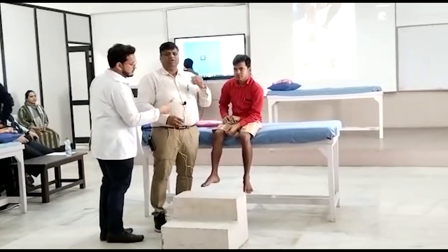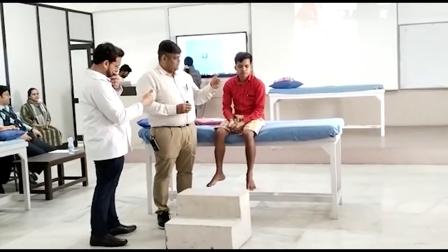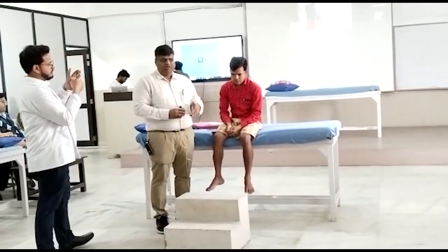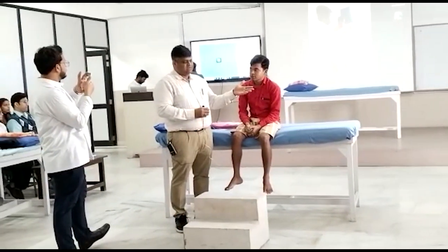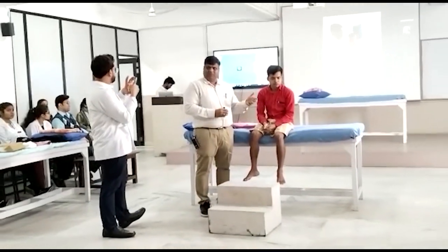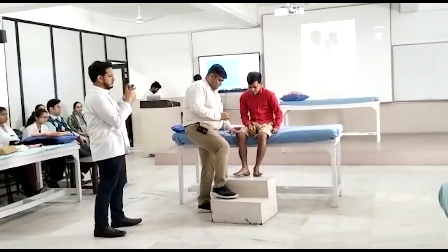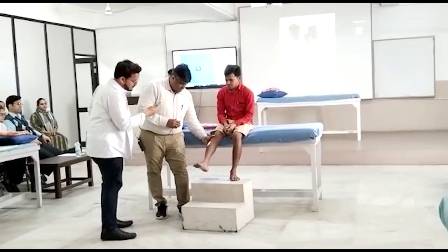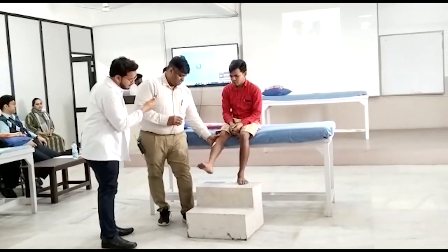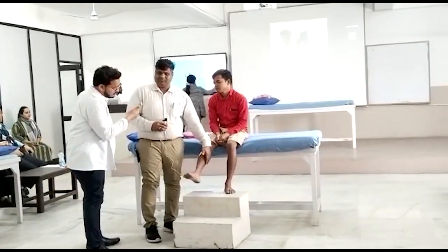What I am going to do is set the dorsiflexor more than the normal desired range — what we wanted to achieve for walking. As we discussed, somebody said it is 10 degrees or 15 degrees of dorsiflexion required for walking. So what we will do is set it at more than 10 degrees of dorsiflexion. It is quite neutral because we don't have any counter effect of spasticity.